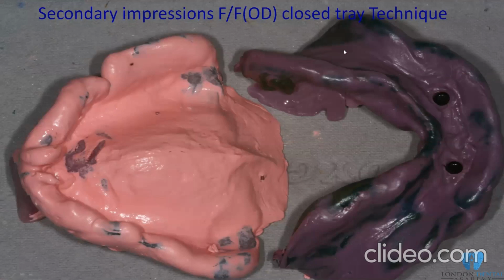And to be honest with you, here in these cases, picking up, look at the border molding, look at the impression and the ridge. I think this is a different patient from the one we saw for the locators. This patient I would treat without implants happily, confidently and predictably, because I know these people will have good retention at the end of the day.